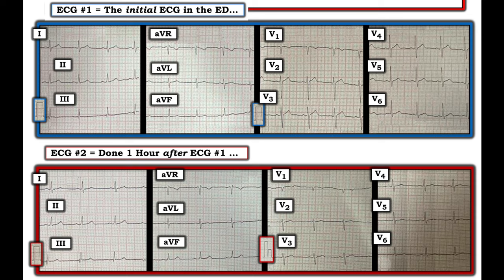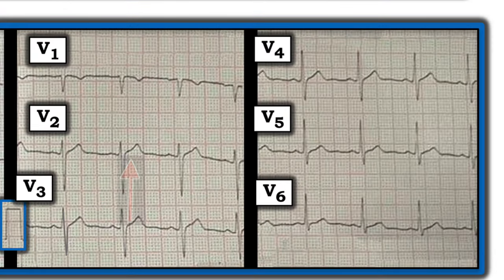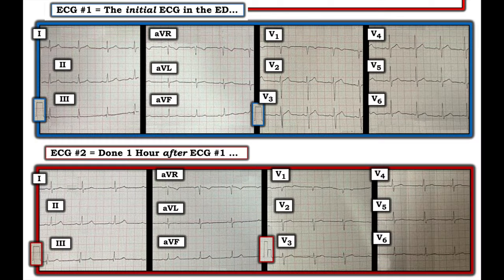Last minute, hyperacute T waves. This one is not obvious. In retrospect, this was hyperacute. But even if you didn't know that, there were dynamic ECG changes, weren't there?